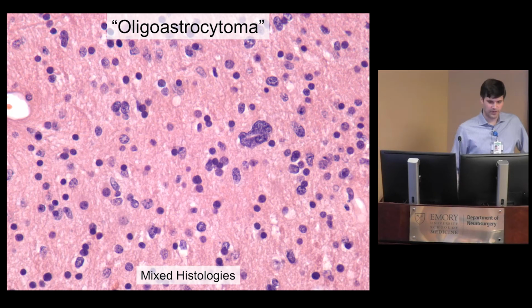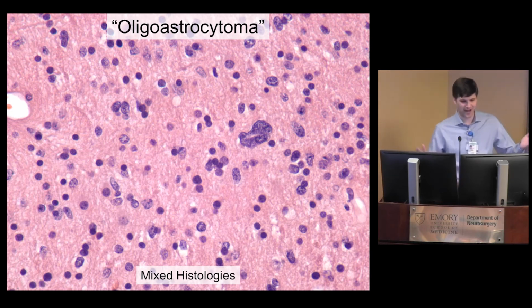So then when we looked at tumors with a mixture of those two, big weird cells, as well as lots of tumor cells with very rounded tumor nuclei, well, we saw it's kind of a mix of the two. It's divergent differentiation. So we would say, okay, oligoastrocytoma.